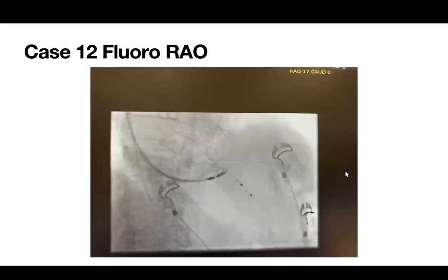So quick question, Vartan. Are you routinely putting the ECG leads lower now? Yeah, the last 10 cases, I've been putting it like this, putting the V1 lower. I feel like there's no downside to it. The other thing I've been thinking is whether I should leave it there and maybe put V3 or V4, which are kind of useless leads during the case, and put it here to have 2 different ones to kind of see, so that in case it's a case, you know.